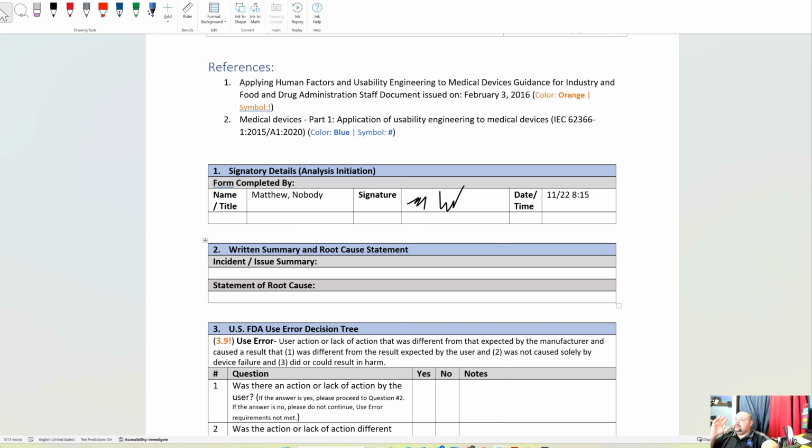Now, to the important things. The summary of the issue is when the user presses the on-screen buttons too fast, the system forces a sudden restart. Okay, that's just what happens. Push the buttons too quick, system restarts.